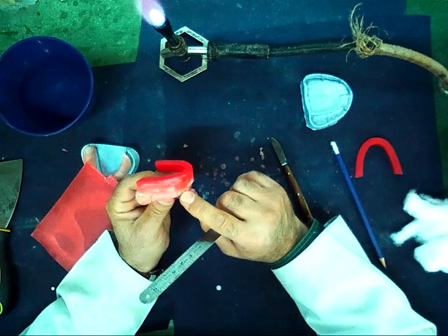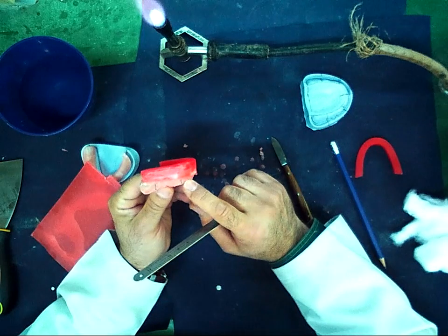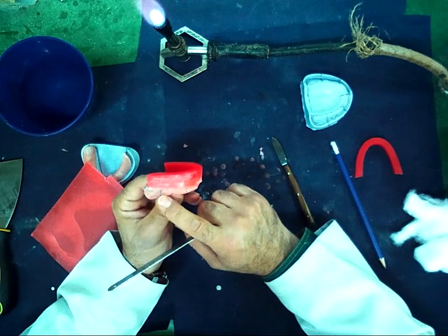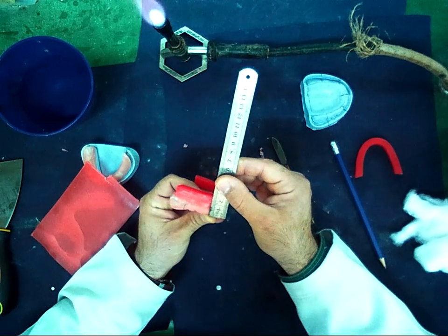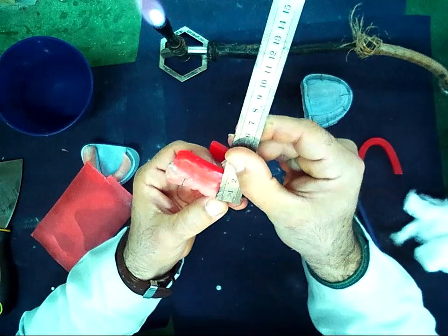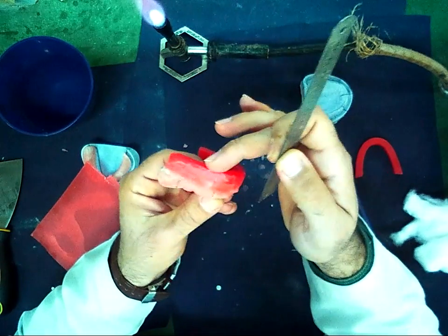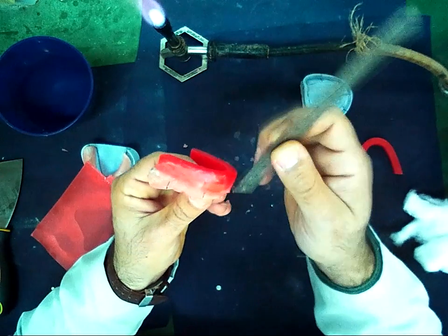The anterior part of the bite rim should be 22 mm, and the molar part should be 18 mm. We start from the beginning of the flanges of the record base to the occlusal surface, or occlusal plane, of the wax.